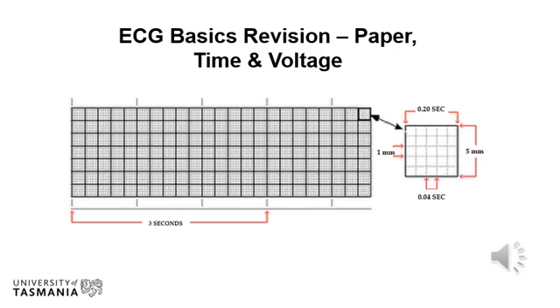The vertical distance on the ECG paper indicates voltage of the electrical signal. When calibrated correctly and set on the machine's default setting, one small square in the vertical direction represents 0.1 millivolts. With this in mind, 10 small squares equals 1 millivolt in amplitude.